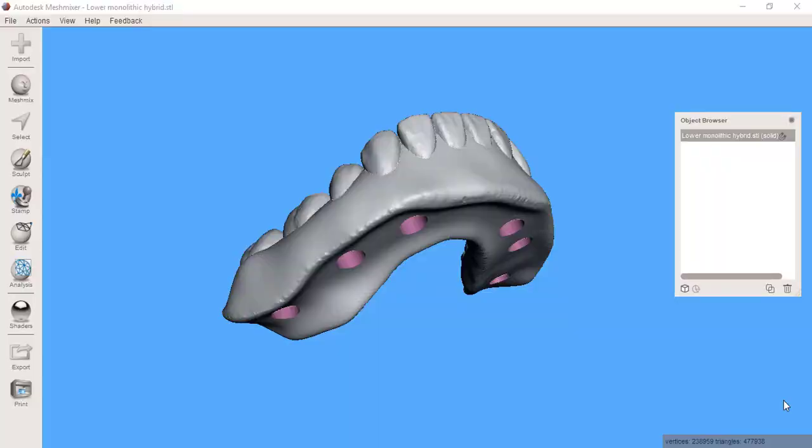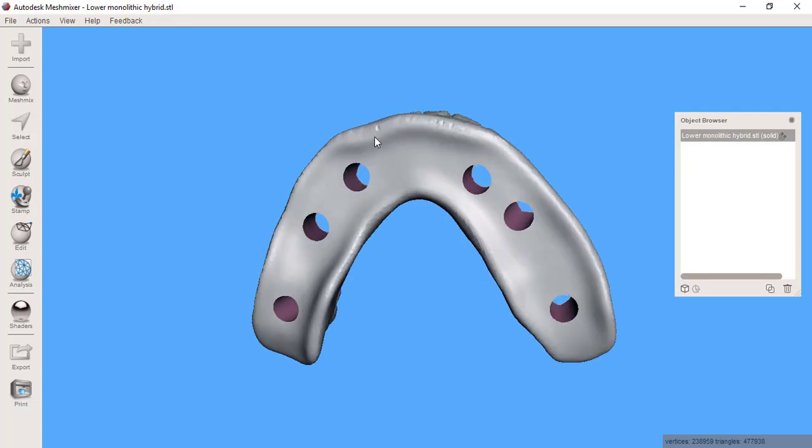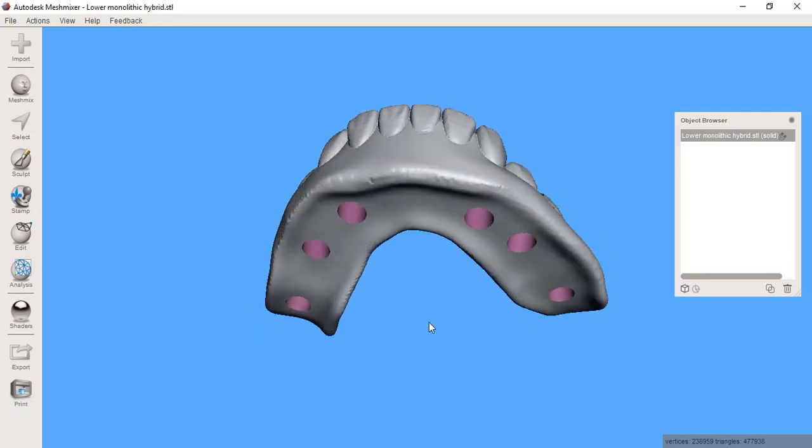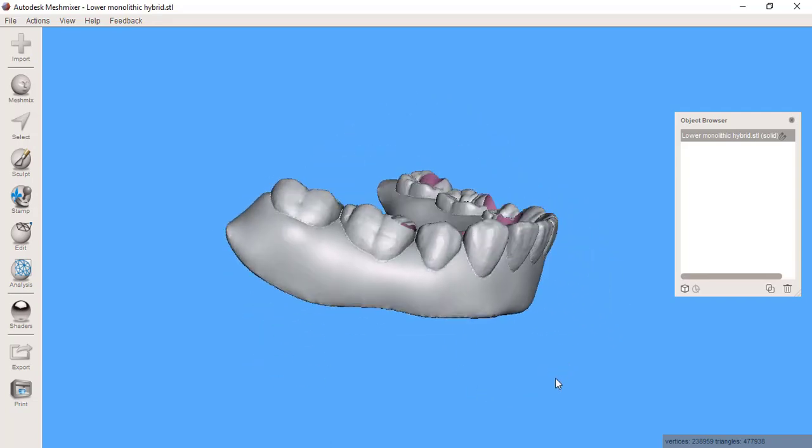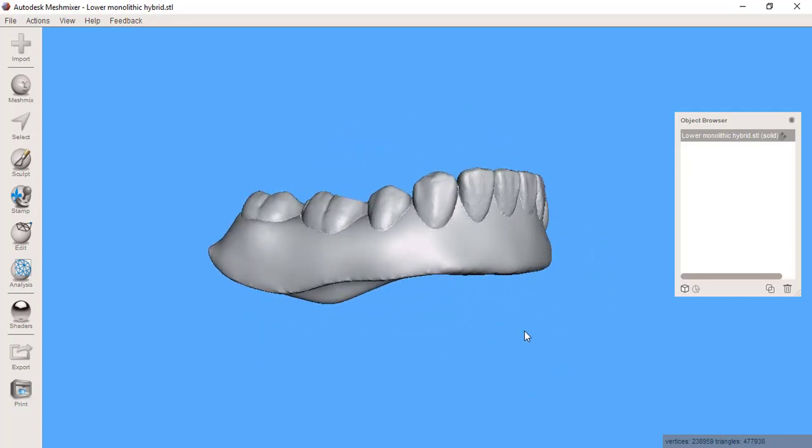In this video I'm going to be showing an alternative method for adding some reinforcement to a temporary printed hybrid prosthesis.